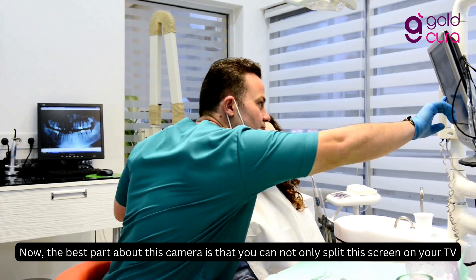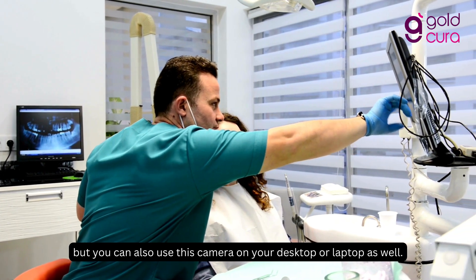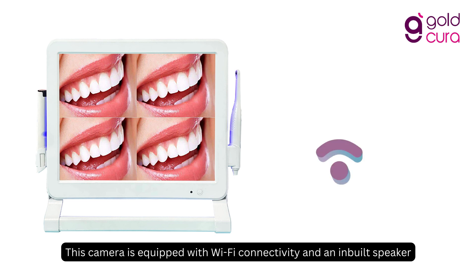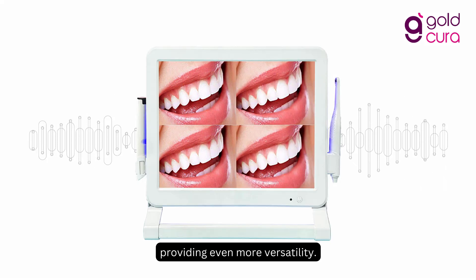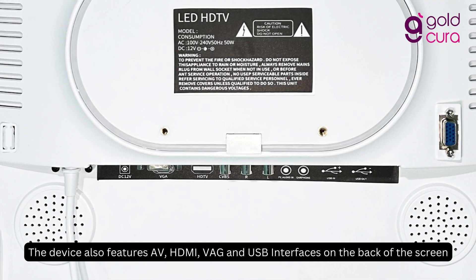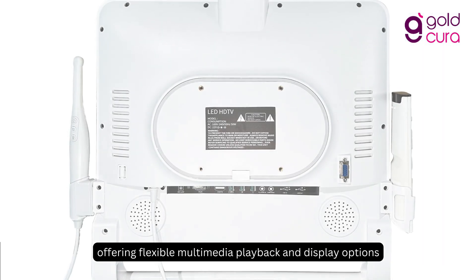The best part about this camera is that you can not only split this screen on your TV, but you can also use this camera on your desktop or laptop as well. This camera is equipped with Wi-Fi connectivity and an in-built speaker, providing even more versatility. The device also features AV, HDMI, VGA, and USB interfaces on the back of the screen, offering flexible multimedia playback and display options.